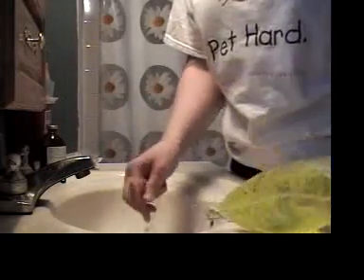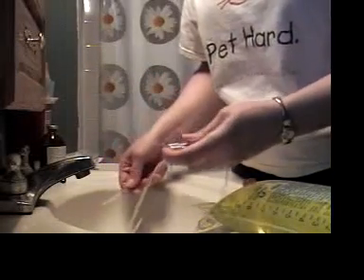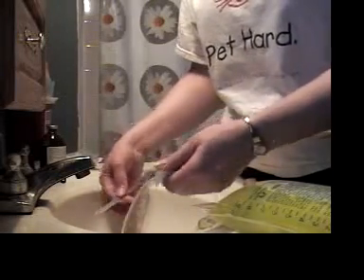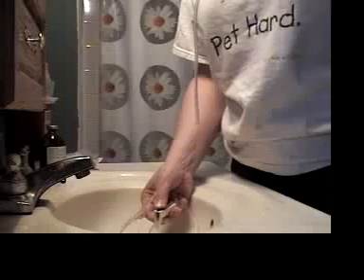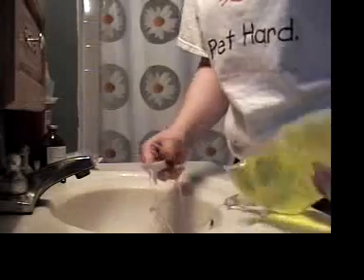Then I just open the line. You open the line using this roller. I just open it a little bit and let enough fluid run through the line that there's little to no air in the line. The higher the bag is, the more the fluid will flow. That's all I need in this case. I am ready to go.